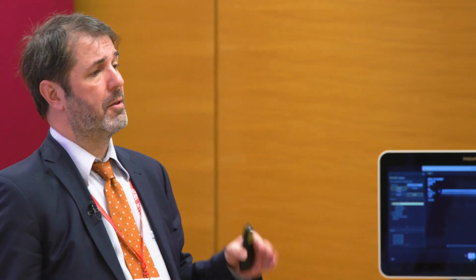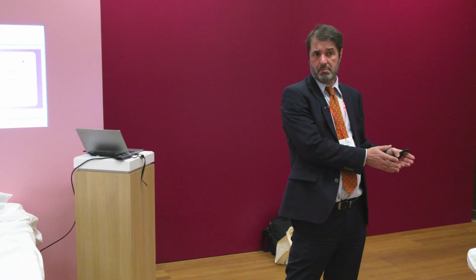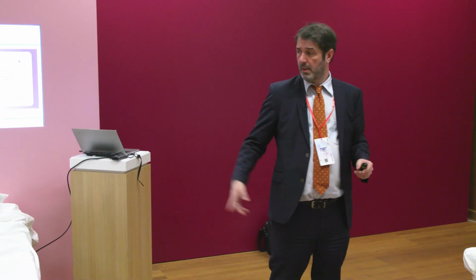Okay. That is the hook. Sometimes they don't have images available, but most of the patients have something strange in CT or MRI, and then they come with CT and said, could we match it? And with this system, you can do fusion in less than a minute. Really very, very fast. So this is something that you want to put in the ultrasound machine? Yes, it's on the ultrasound.